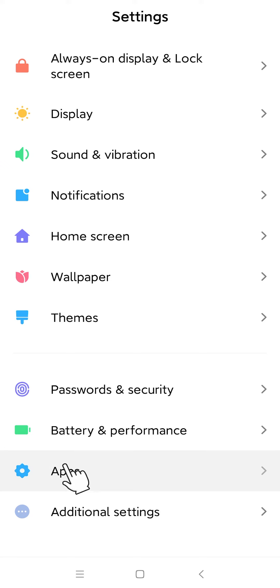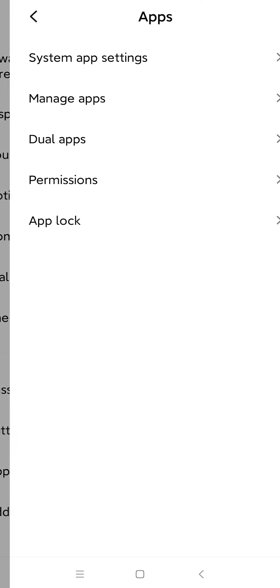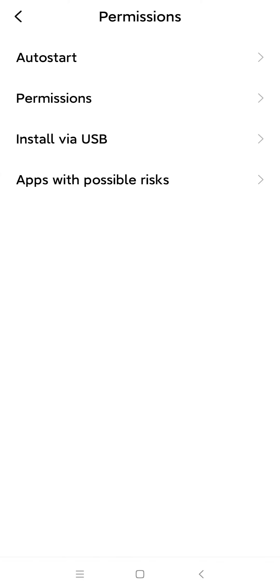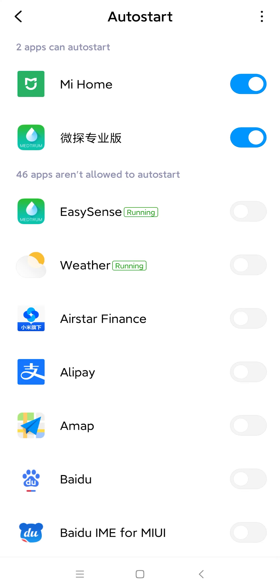Select Apps just below the Password and Security option. Go to Permissions, Auto Start, and select the EasySense app.